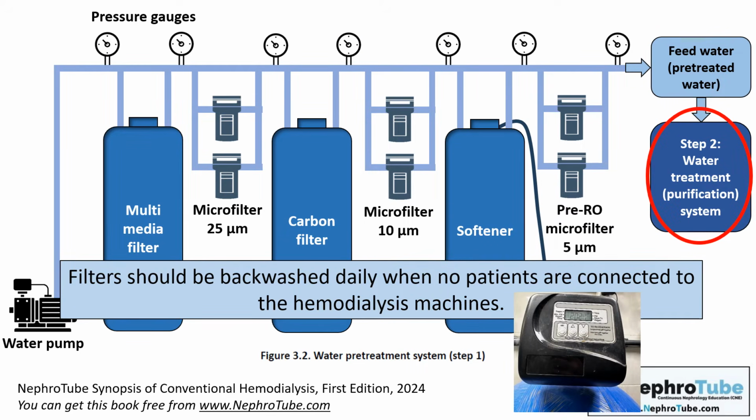Now we have to go to the next step. Now we formed what is called the feed water or pre-treated water, that will go to the next step, which is called water treatment system or purification system.